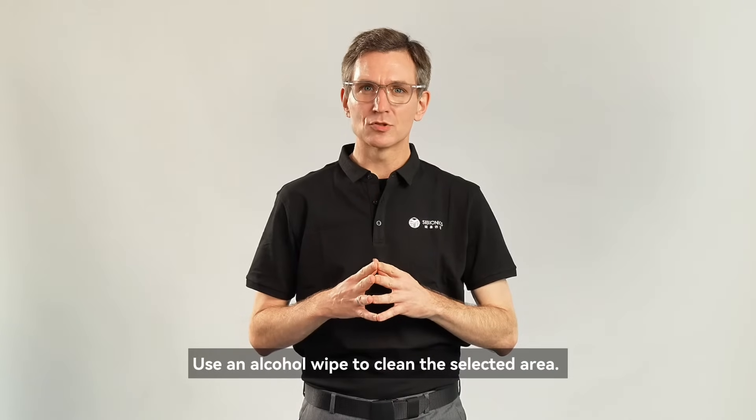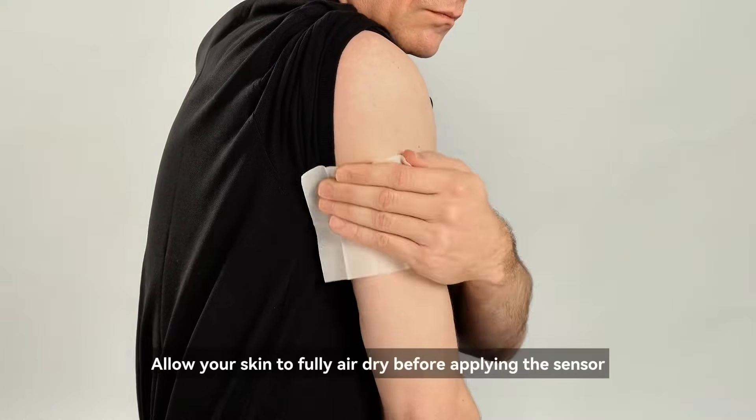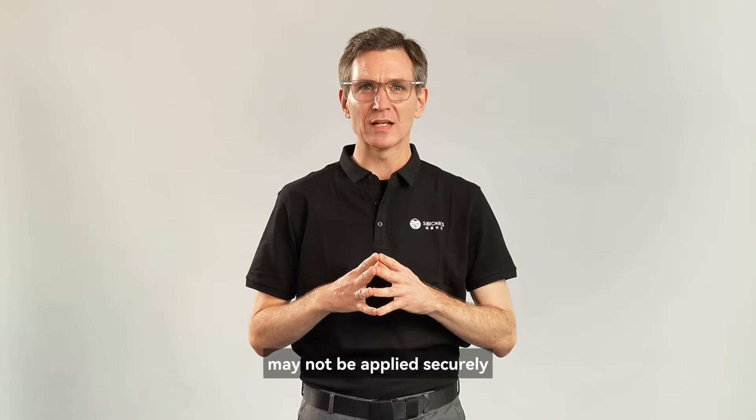Use an alcohol wipe to clean the selected area. Allow your skin to fully air dry before applying the sensor, otherwise the adhesive on the back of the sensor may not be applied securely.